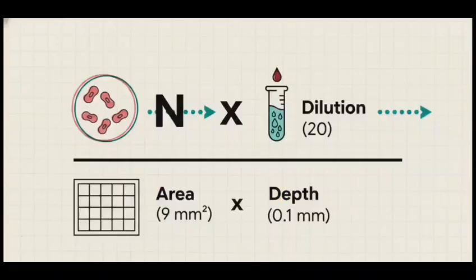All right, so how do we get from a cell count to the final answer? It all comes down to this formula, and it makes perfect sense if you think about it.